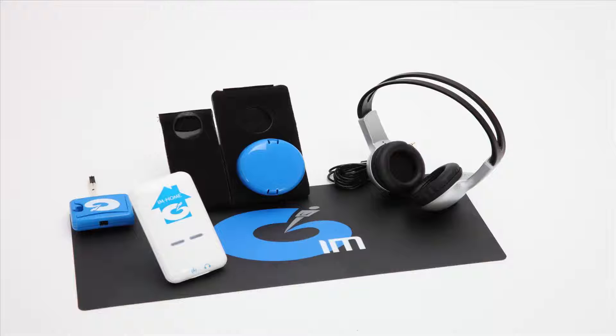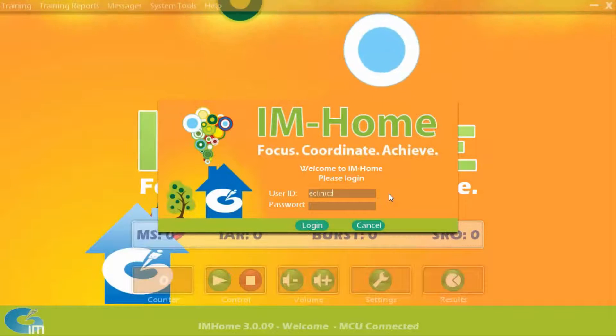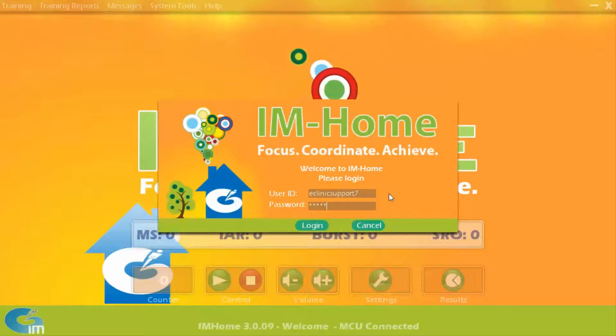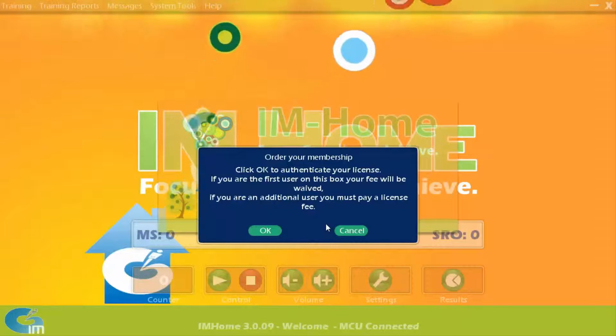Install and then open the I Am Home software — you will see this screen appear. Attach the I Am Home master control unit, or MCU, to your PC or Mac. Login to the I Am Home software with a member username and password. Once the member username and password are accepted in the software, a window appears informing you that the license must be authenticated. Click OK.